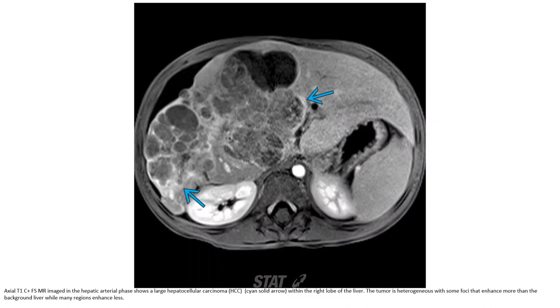On T1C+ hepatobiliary agent image in the hepatic arterial phase, a large hepatocellular carcinoma is seen within the right lobe of the liver. The tumor is heterogeneous, with some foci that enhance more than the background liver, while many regions enhance less.